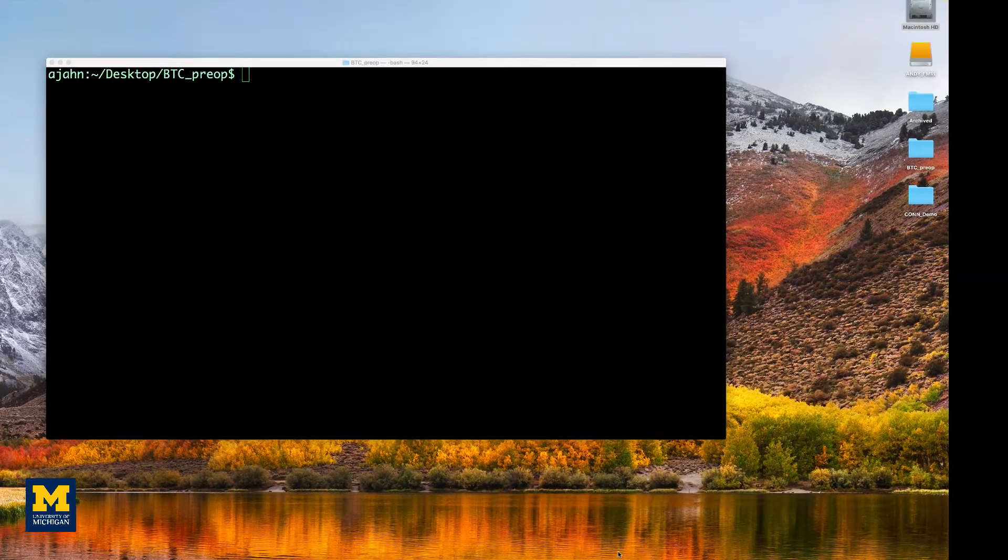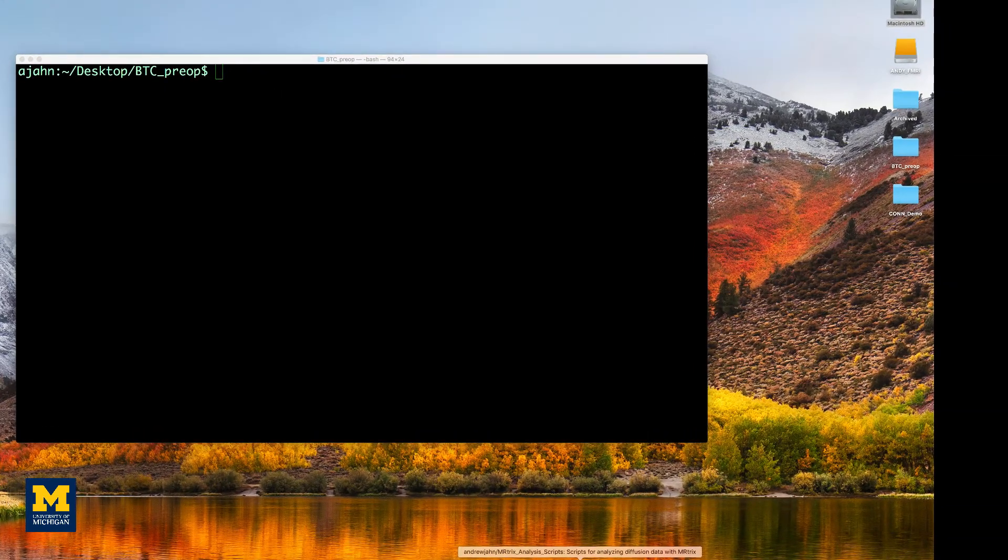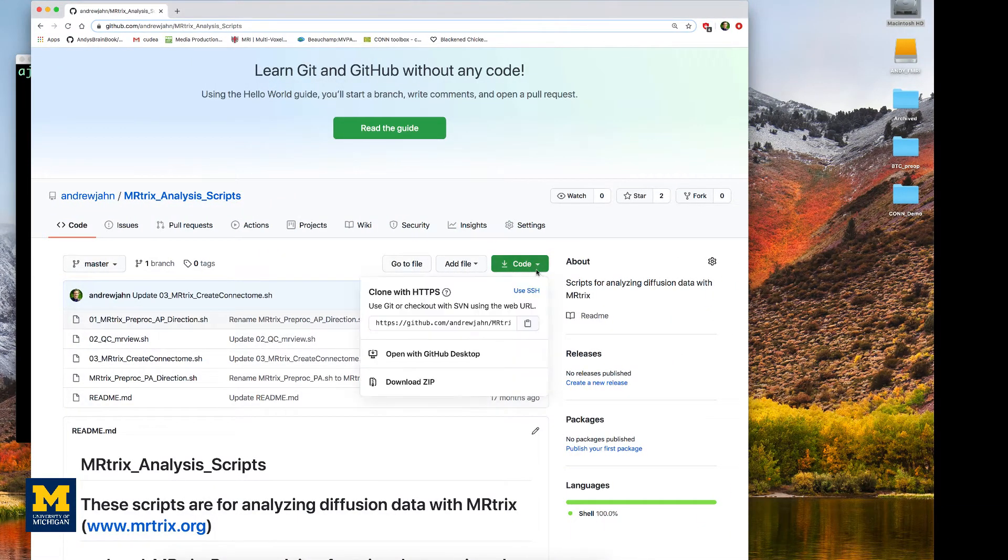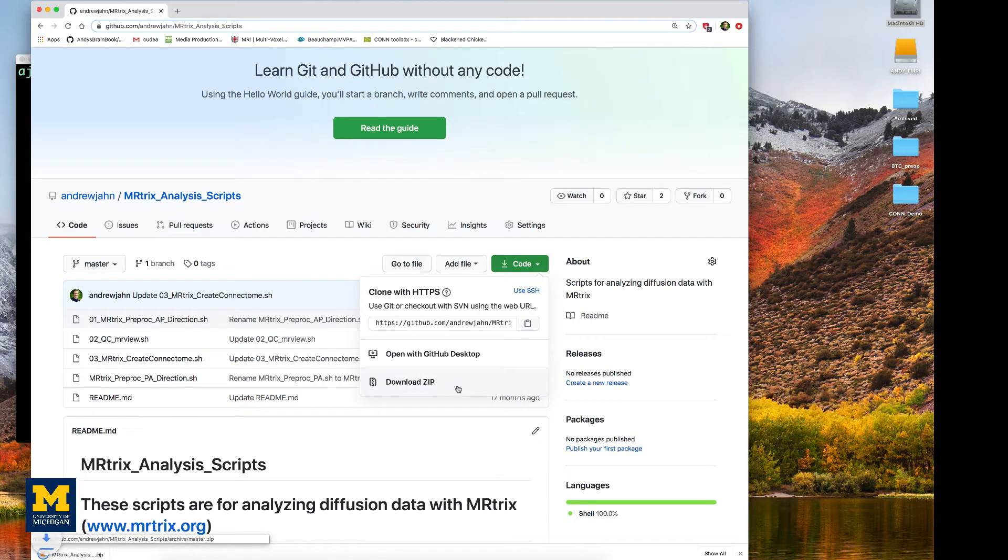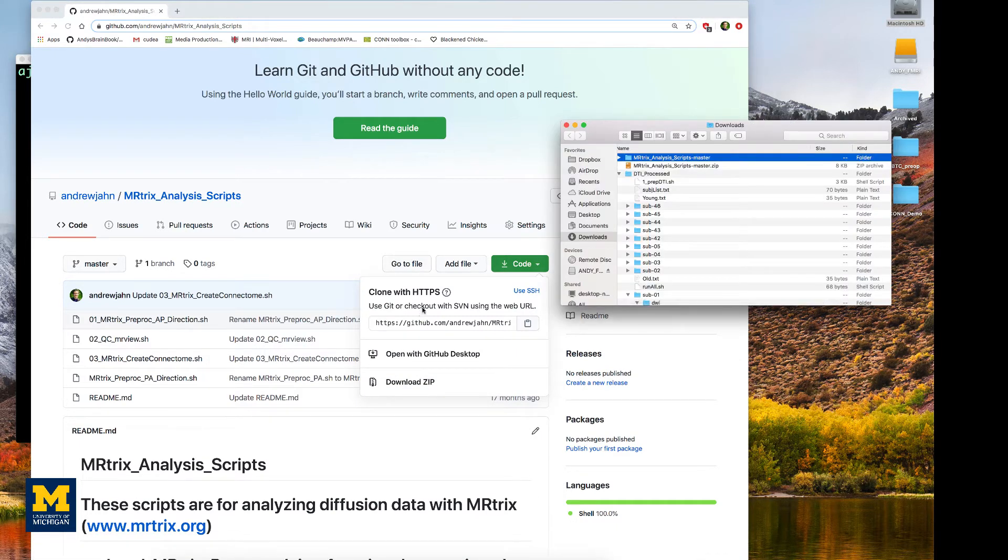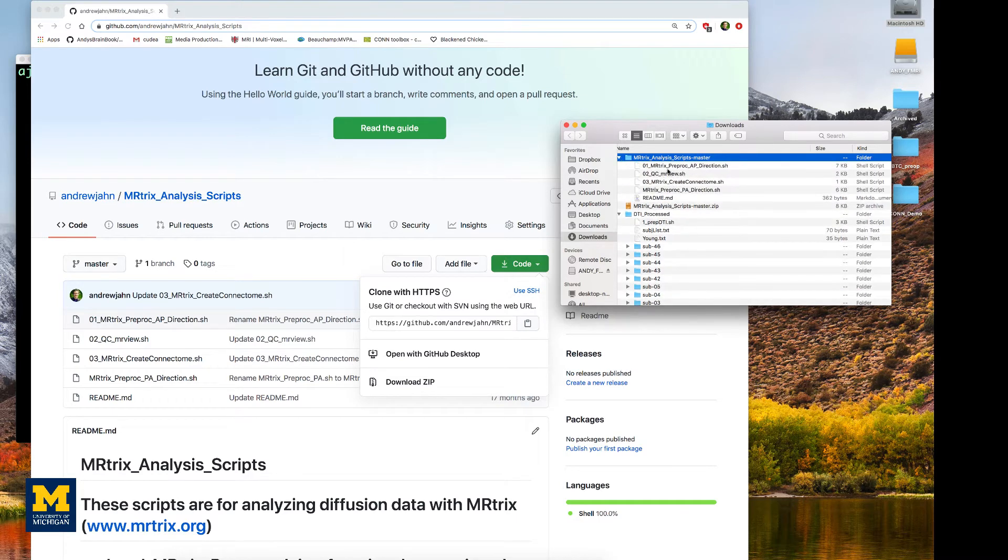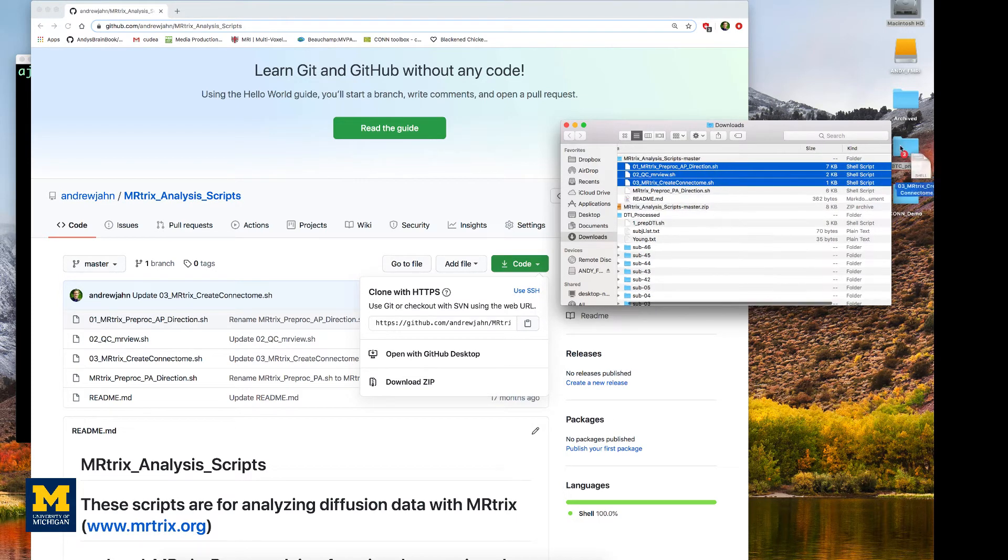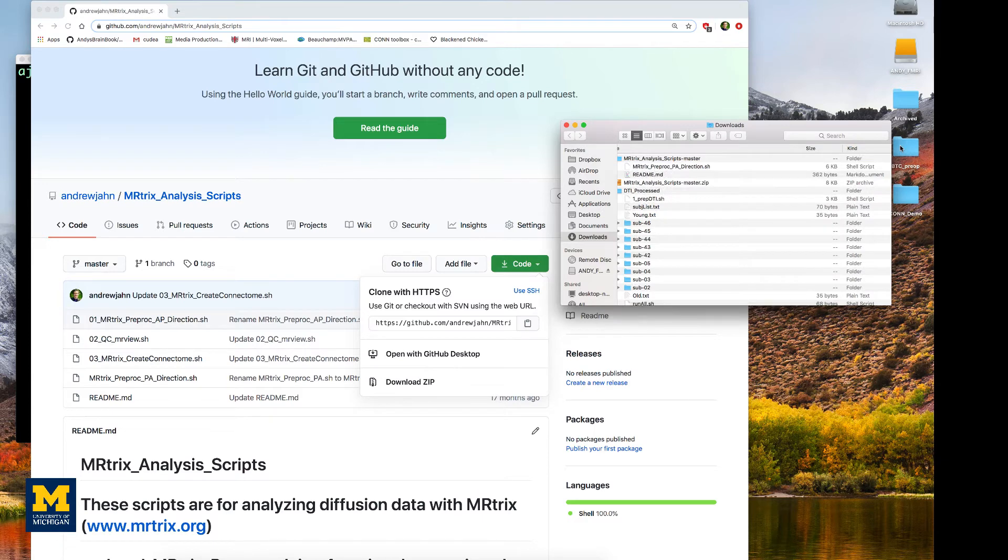Before going on, download the pre-processing scripts located in the link down below. You can download it by clicking code download zip. Once you've unzipped it, go to that folder and copy all of these scripts into the BTC pre-op folder.